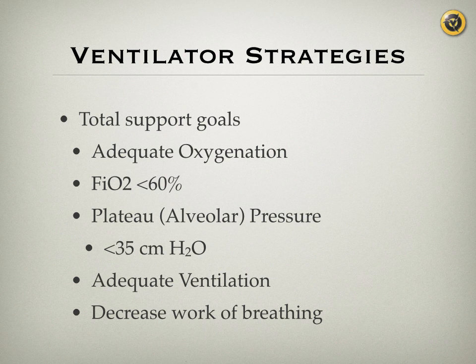You use a higher FiO2, you use higher pressures, you use higher volumes, you use everything to get the saturation to 90. After you achieve that, you want your FiO2 to be reduced to 60 or lower, because oxygen toxicity is recognized with more than 60% for 6 hours or more. You have superoxide radicals, you have cilia destruction, and you have difficulty clearing secretions for patients who are intubated, and so forth. So you would like to reduce FiO2.